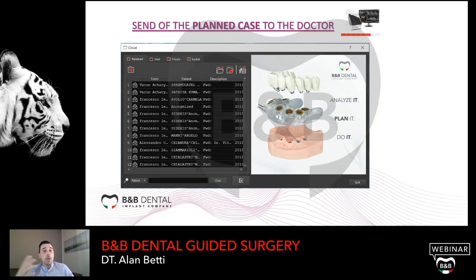This is our cloud. After the planning, we can send it to the doctor, if the doctor wants, or if the plan is done in B&B Dental, of course. We have the possibility to share the project with the doctor by mail.